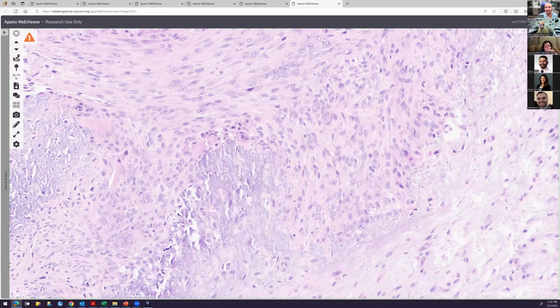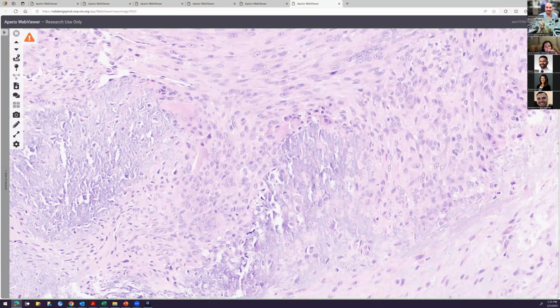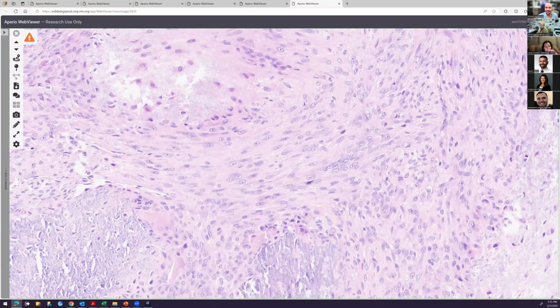Tumoral calcinosis, maybe. Okay, that's a thought, right? Because you get multinucleated giant cells surrounding areas of calcifications. So tumoral calcinosis, possible, but then you get this spindled stroma in tumoral calcinosis. No, not really, right? Anything else? Chondroblastoma.